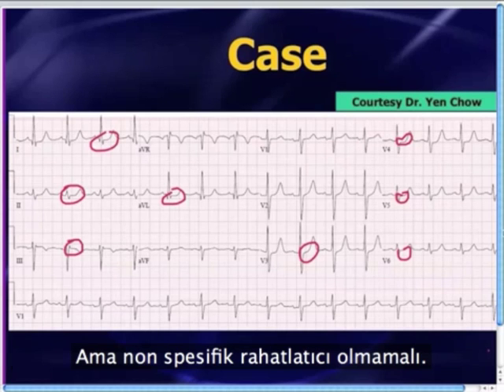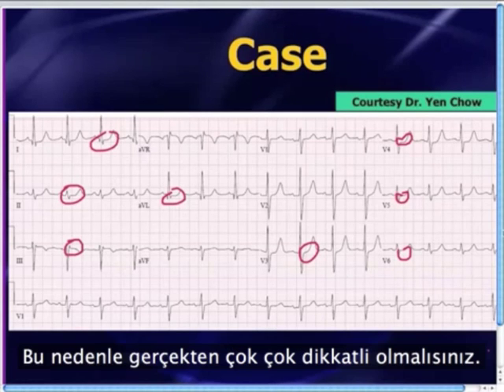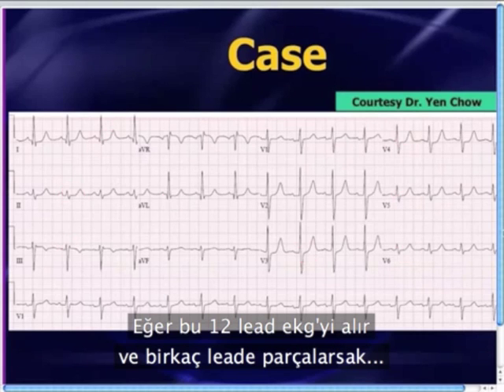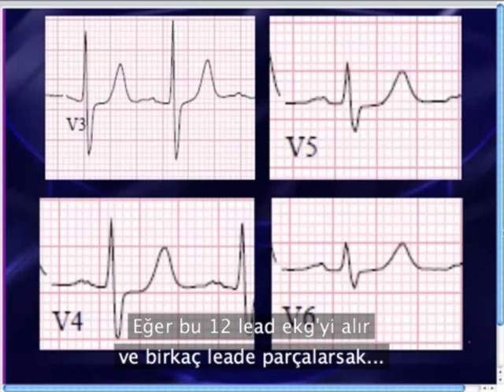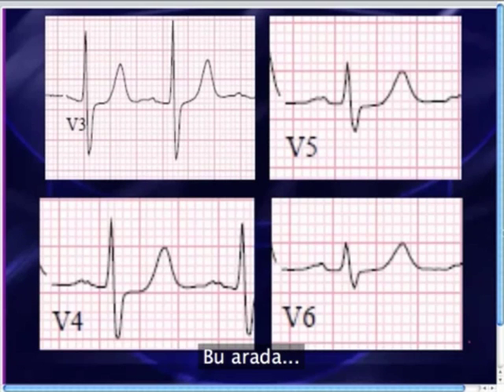Nonspecific should not be reassuring, because a person can have major disease with only mild ST segment changes — less than a millimeter. You really need to be very careful about that. If we take this 12-lead EKG and blow it up — just blowing up a couple of leads — you can perhaps appreciate the ST segment changes a little bit better.